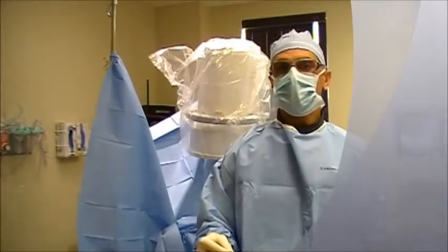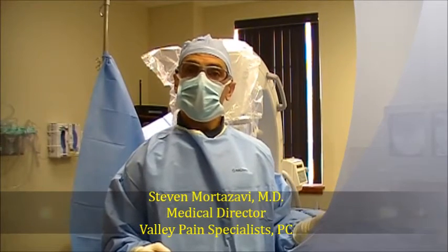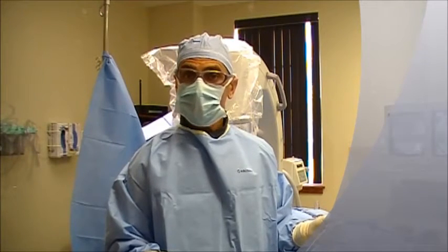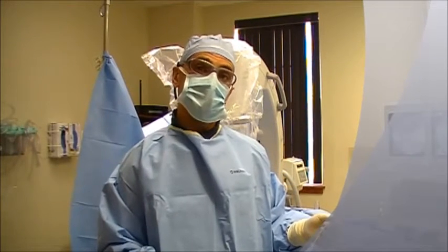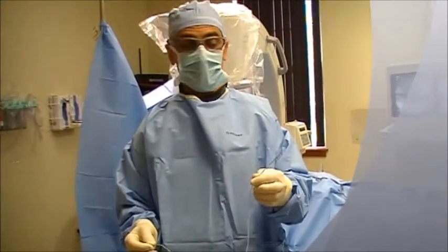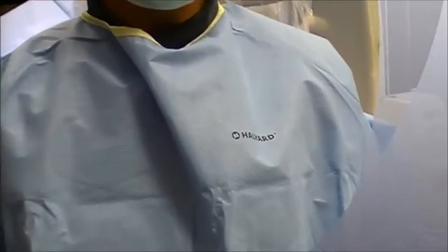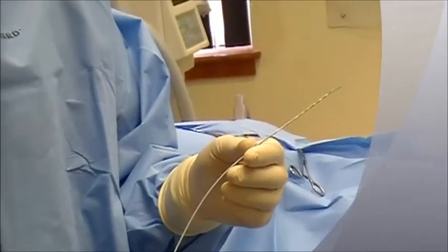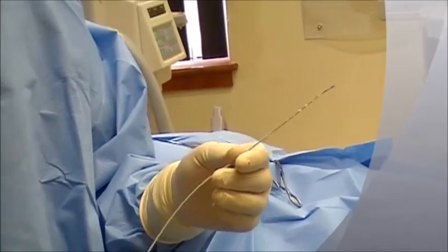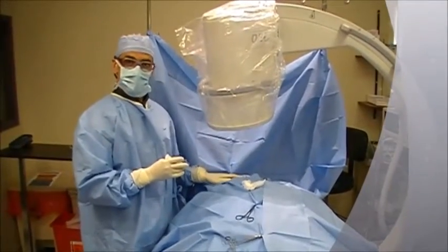We're going to be doing a spinal cord stimulator trial for this patient. The patient has intractable left C6 cervical radiculopathy and has failed other conservative treatments. What I have in front of me is a Medtronic compact lead — an eight-contact lead — which we'll be placing in the cervical region, probably around the C6 cervical vertebra. We'll be showing that along with the fluoroscopic images that confirm placement.